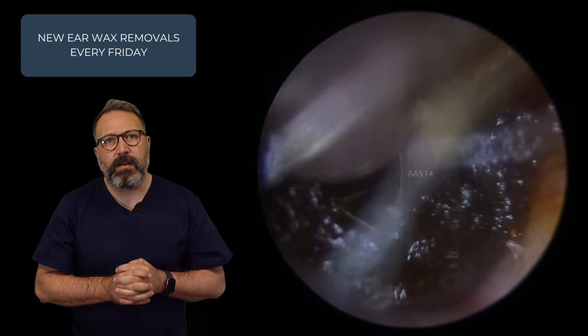I had a gentleman this morning who'd never had his ear cleaned for 50 years — that's coming next week, and oh my goodness, that was a big wax removal. So what we've got now is a much softer type of wax — this is the third patient in the compilation. Stay tuned guys, there's plenty more to come.